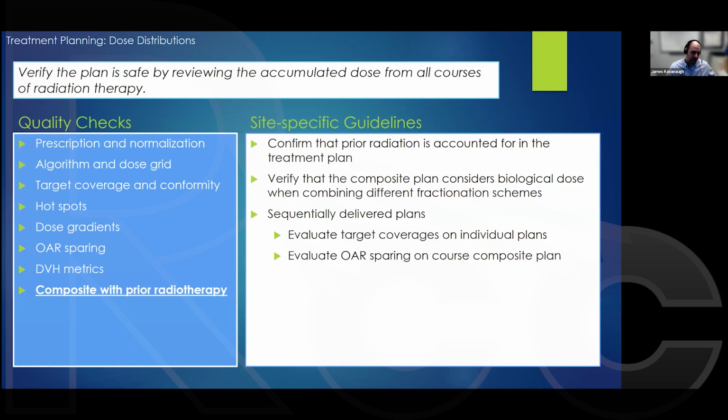And so we start looking at, we do BED calculations, maybe with or without any time allotment to account for the distribution or displacement from previous treatment. And then make your best guess. And that's working with your physician. They'll largely drive it. We aim for, well, it depends on the physician, but we typically aim for safety as best we can while trying to get dose to help our patients as best we can.